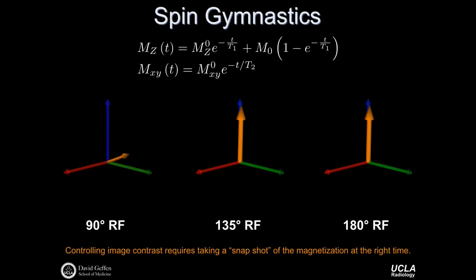So these are different examples of the consequences of RF pulses and relaxation and the equations that describe the free precessional behavior of the bulk magnetization after the application of an RF pulse. In the previous lecture, these expressions were explained and described, although the derivation is not clear at this point in this course.